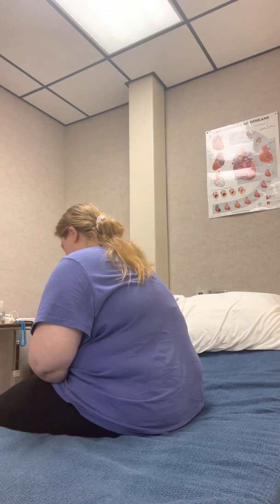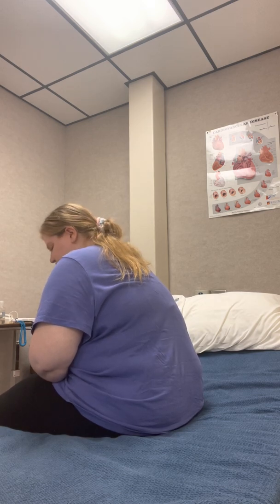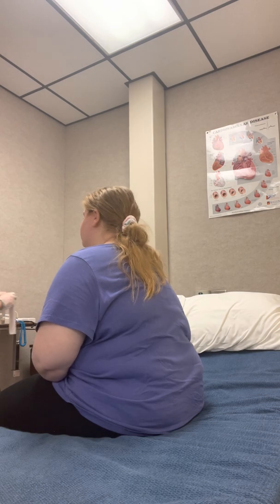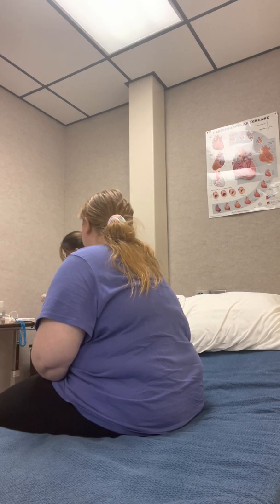Alright. So while I'm looking at your neck, I'm just gonna listen for bruits, which is a sound that you don't want to hear. So I'm gonna have you deep breathe, okay? Inhale. Alright, if you could just hold your breath for a couple seconds. Just gonna take a peek inside of your mouth to make sure that we don't have any lesions and that there isn't any sort of redness or sores that we need to worry about.